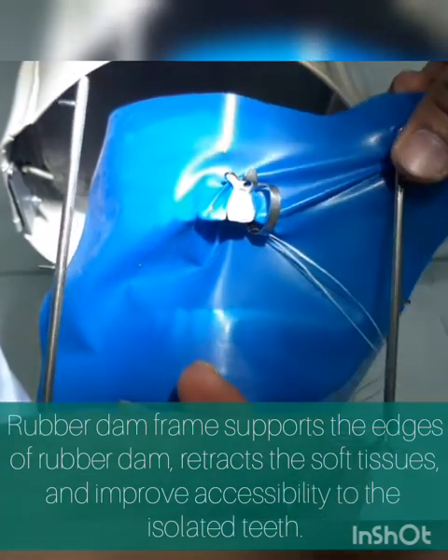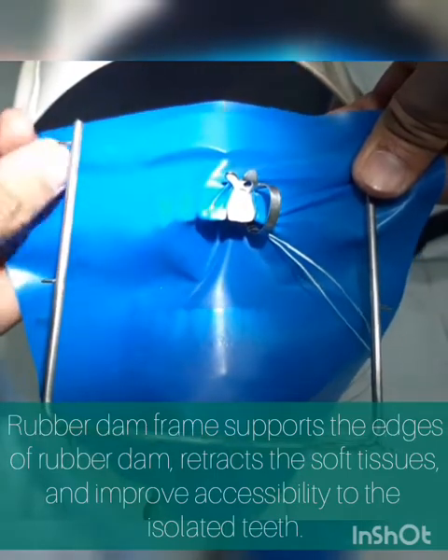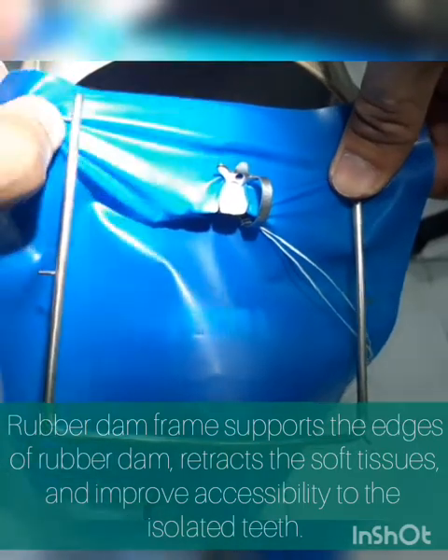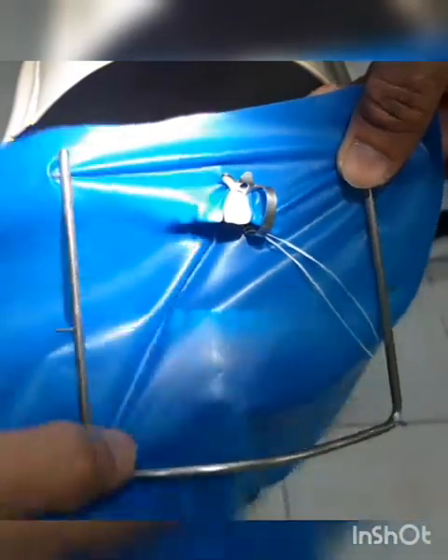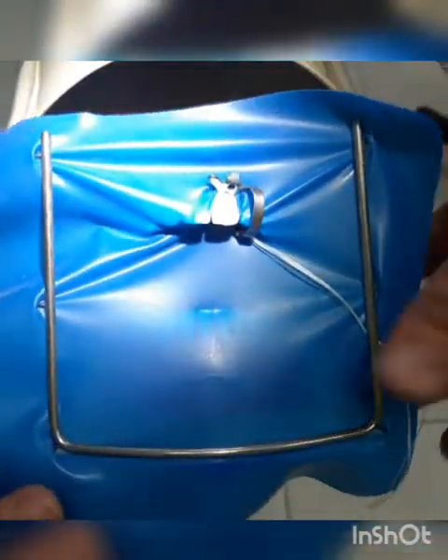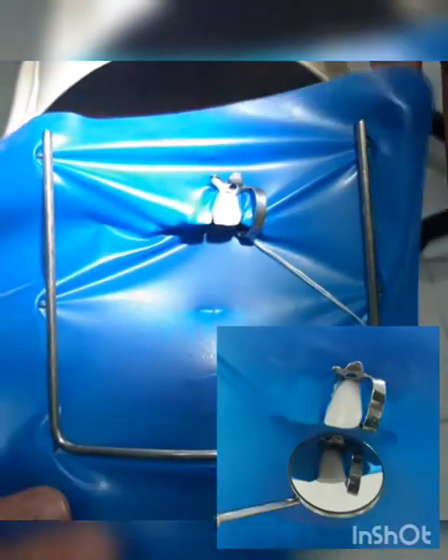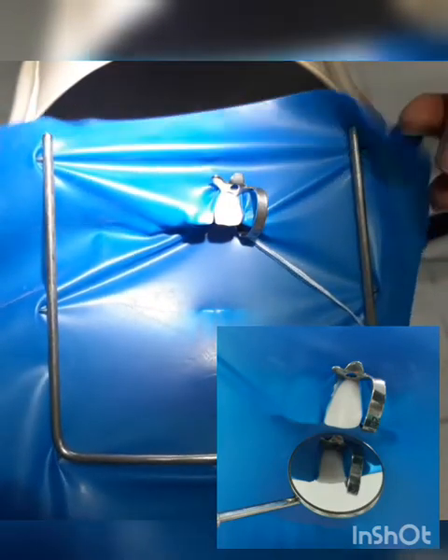Hold your frame on one end and then stretch the rubber dam sheet on the other side, onto the different contacts of your frame. After stretching, you have already isolated the tooth using the rubber dam clamp together with the rubber dam sheet.